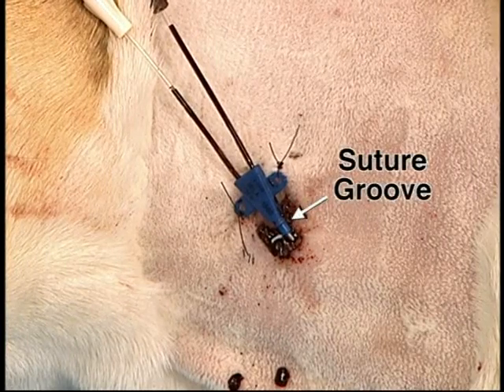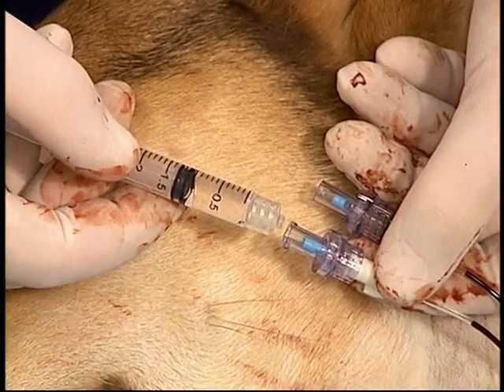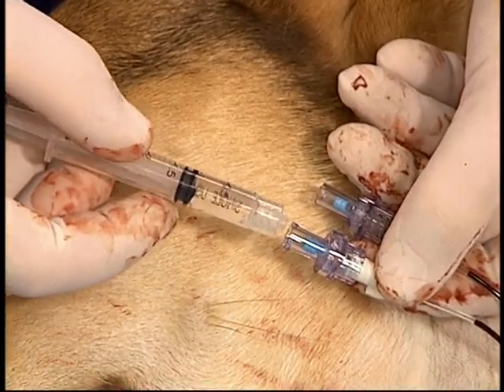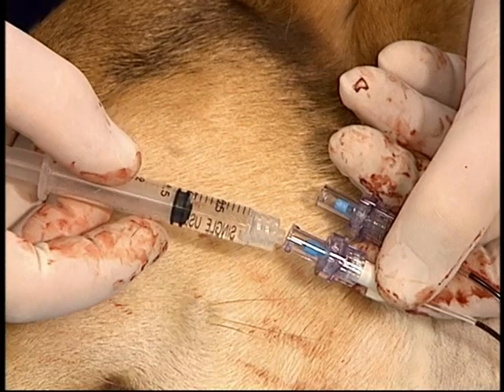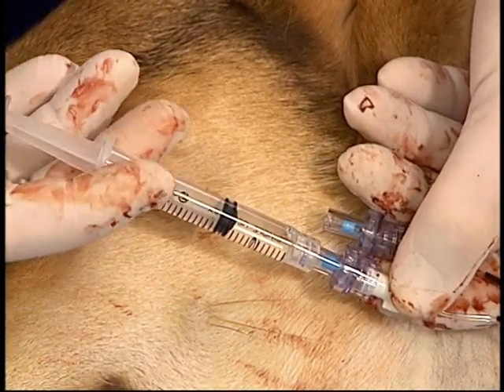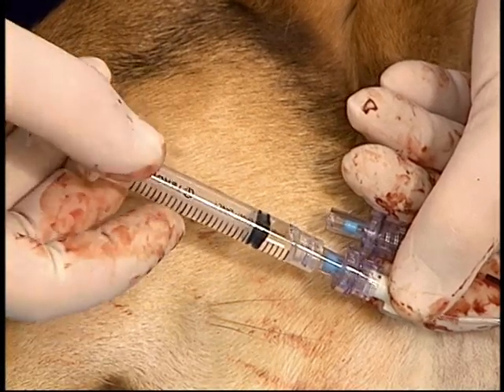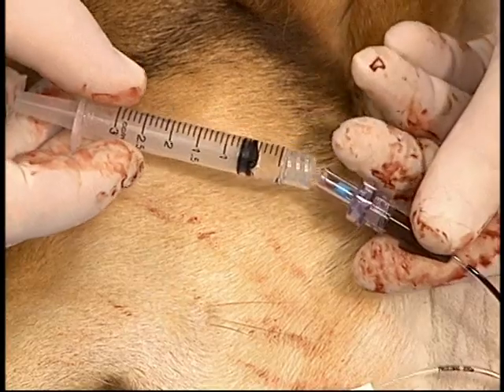For additional security, a third suture can be placed around the distal suture groove and through the skin. Each lumen should then be flushed. The advantage of these needleless injection caps is that fluid cannot come in or out of the catheter until the central valve is depressed. Blood should be aspirated to ensure appropriate location of the catheter, and then the catheter should be bandaged.